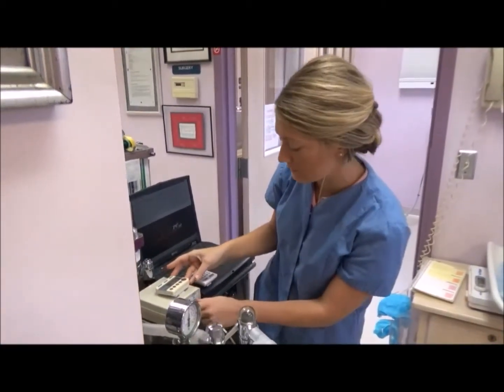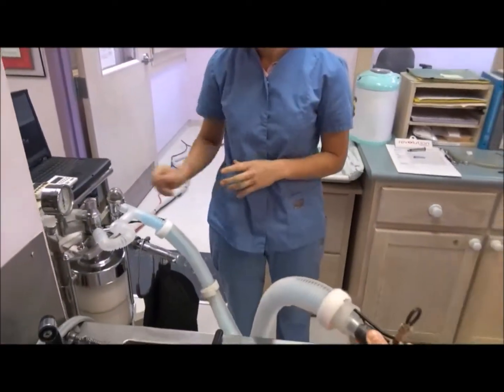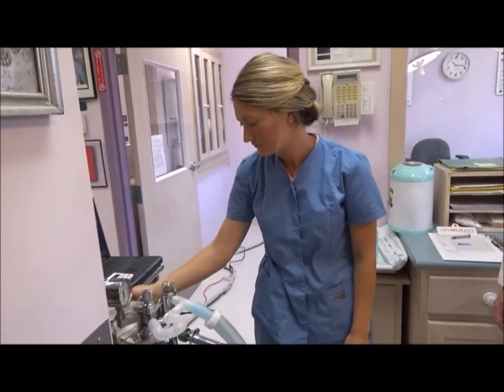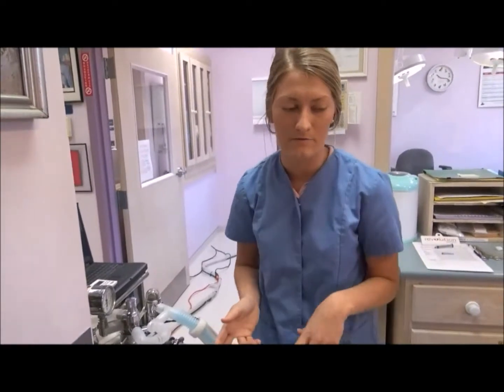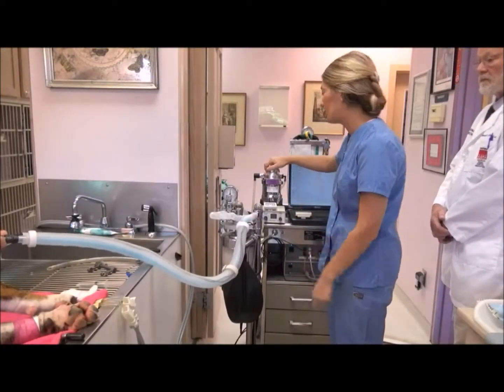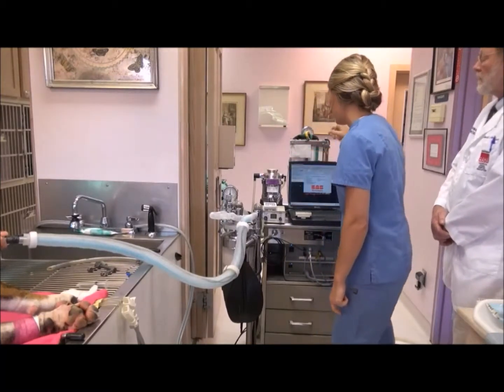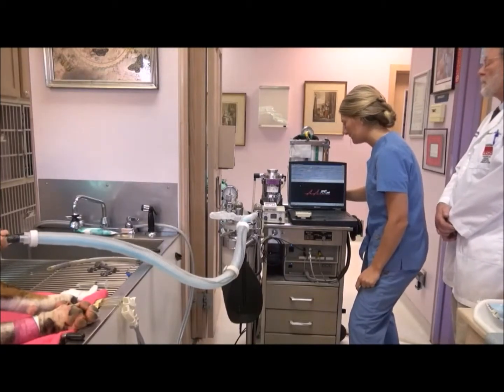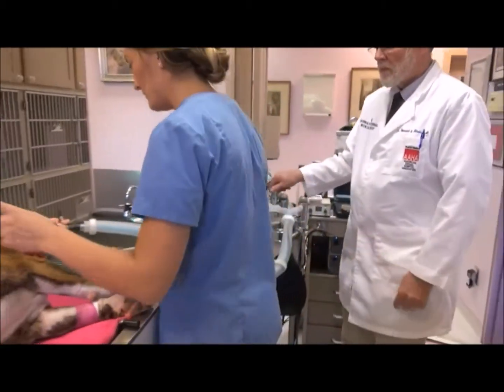We'll turn on our respiratory monitor. And then we'll assess how he's doing after about 3 minutes. Now it's been about 3 minutes, so I'm going to bump down the isoflurane to 2%, and our oxygen down to 1 liter. Okay. So now we're ready to place the endotracheal tube for our patient.